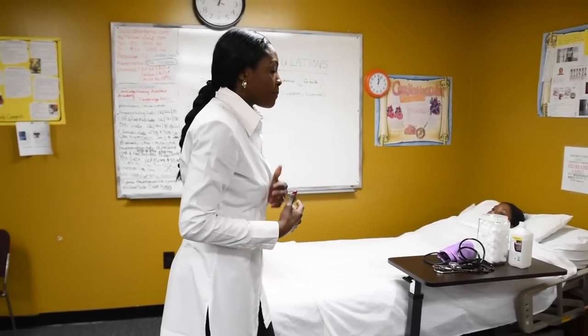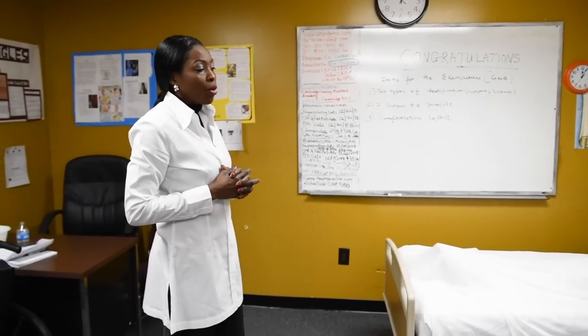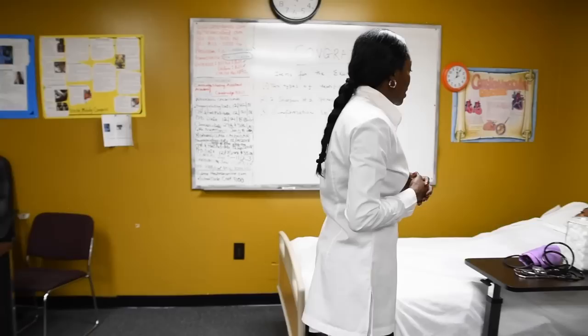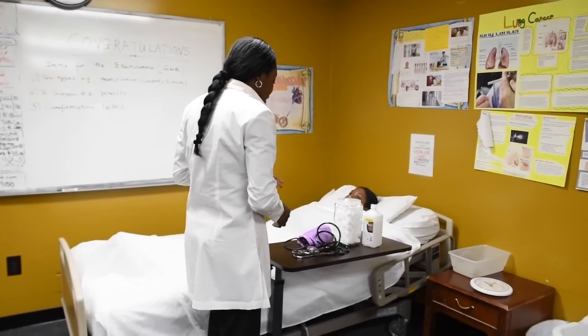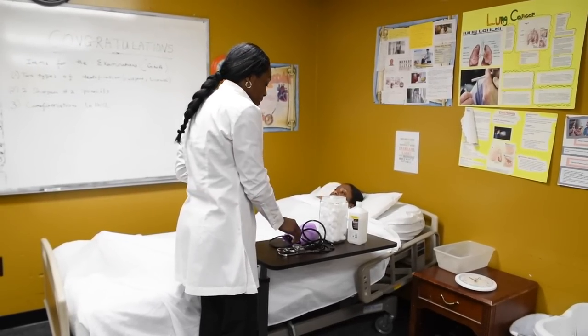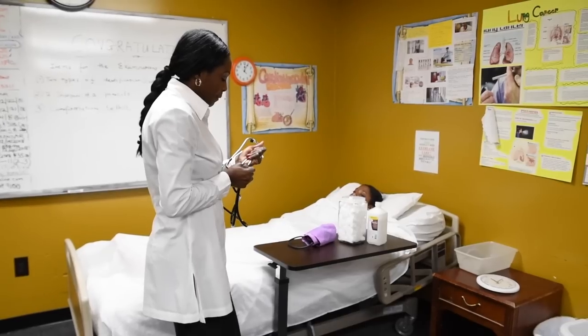This is my exam. I've looked on my exam form and it says measure and record blood pressure. This is what you do once again. Hi, Miss Nafisa, I'm here to take your blood pressure. Is that okay with you? Great. I have my equipment here, and the examiner will get up from their seat and come to the bedside of the patient to do the skill with me, okay?